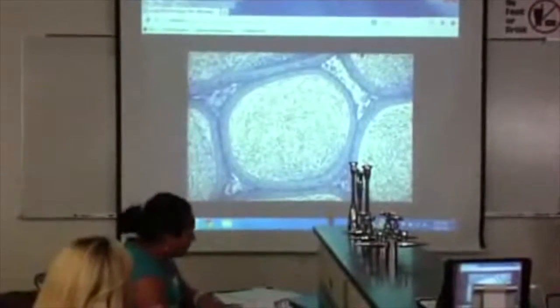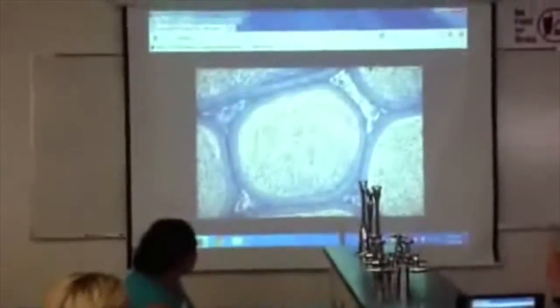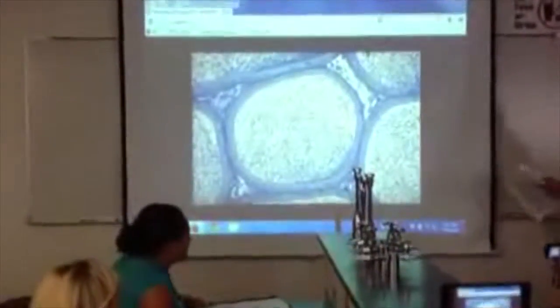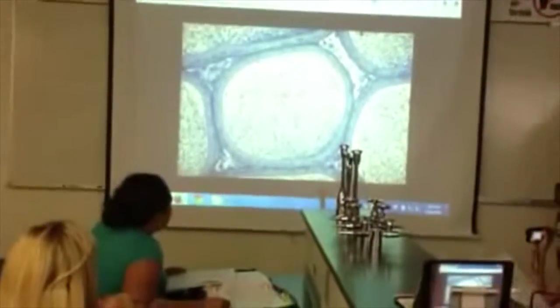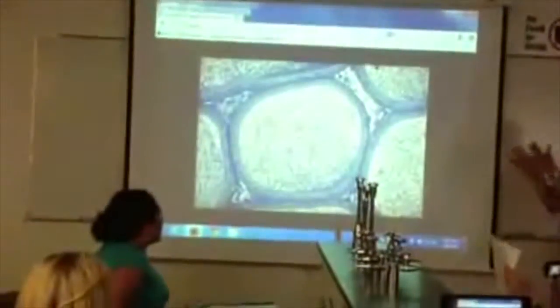Name it. That's sperm. Epididymis. Is this a boy or a girl part? Okay, we're good. We got some marks.